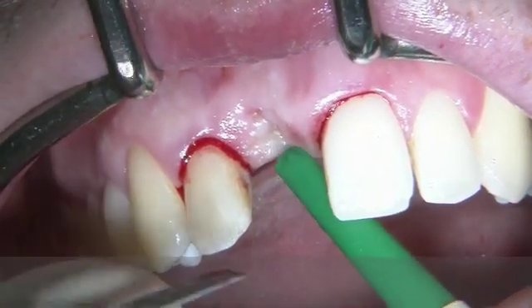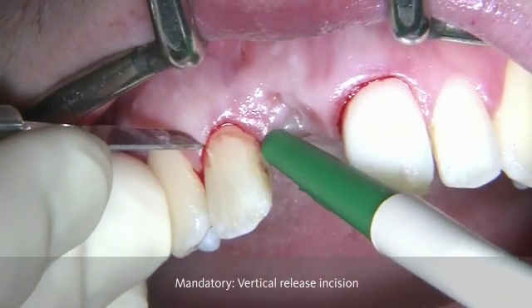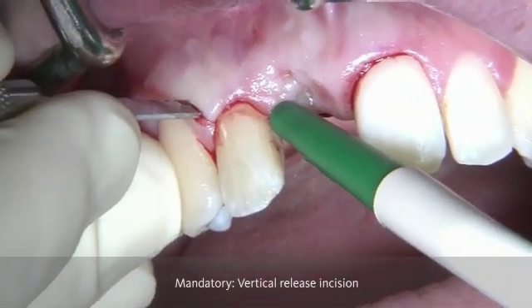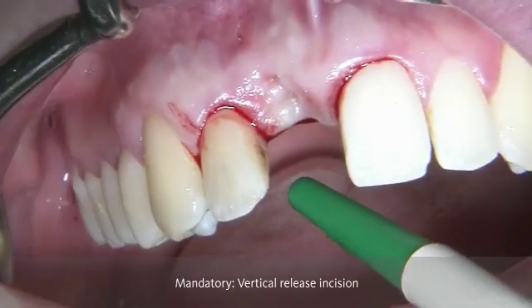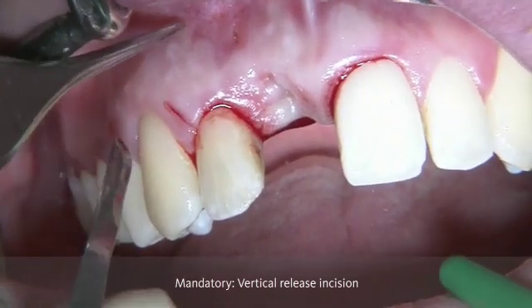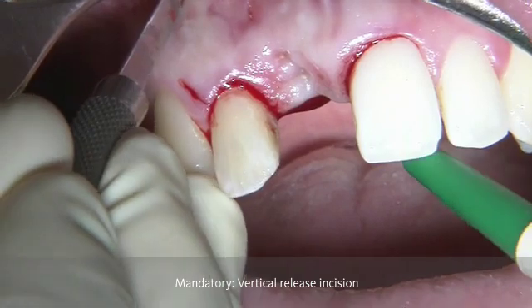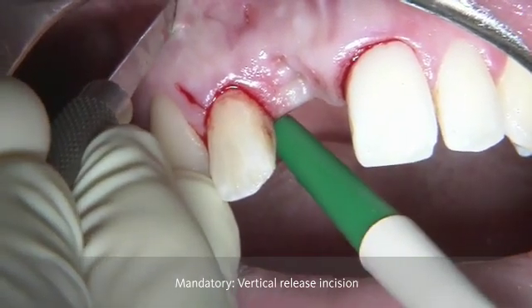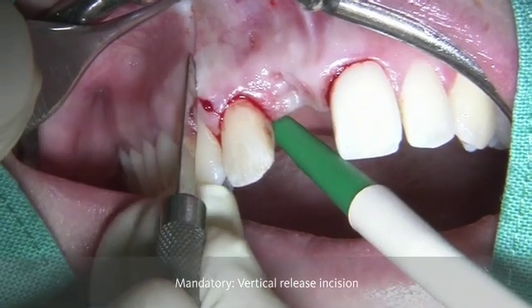It is only necessary to have one vertical releasing incision, which is going to be placed at the distal aspect, starting from the sulcus, perpendicularly, and then to complete the vertical releasing incision by coming from the apical part towards the coronal part, meeting at the initial incision in this area.